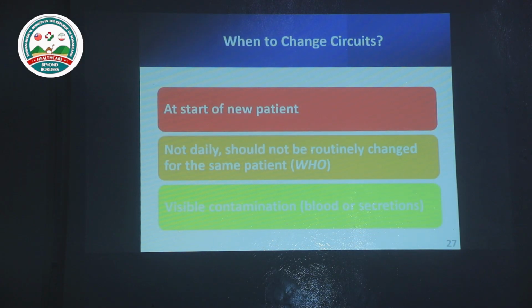Okay, and another thing I would like to mention is when to change the ventilator circuit. The first is at the start of a new patient. So every patient needs to use a new ventilator circuit. And another thing is that if the patient is already using the ventilator, we do not need to change the circuit daily. This is according to the WHO guideline.